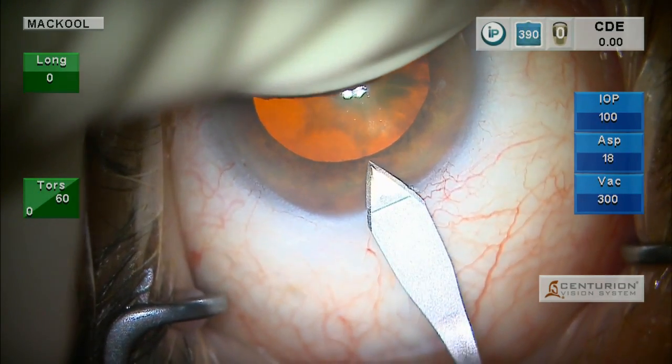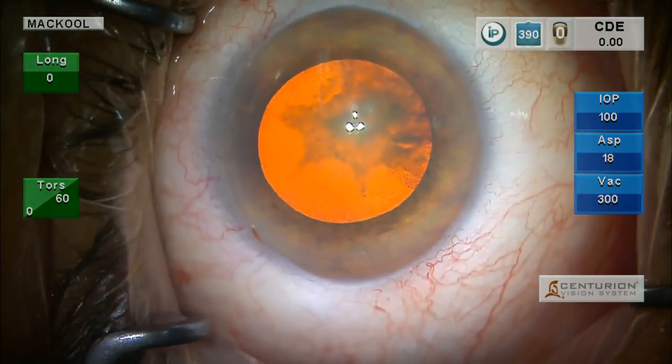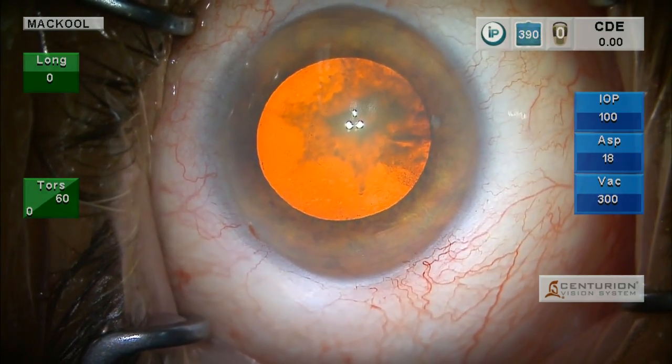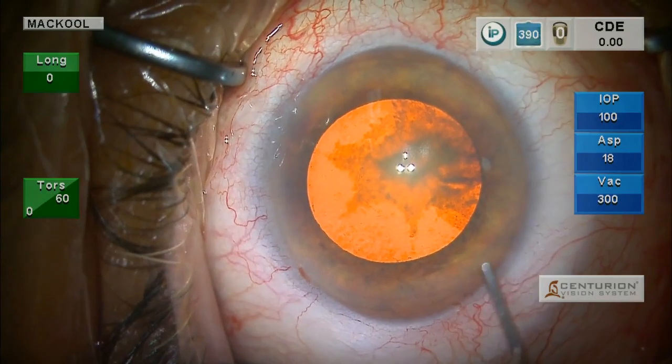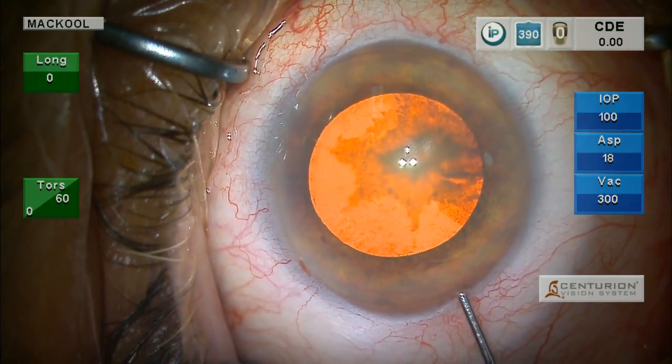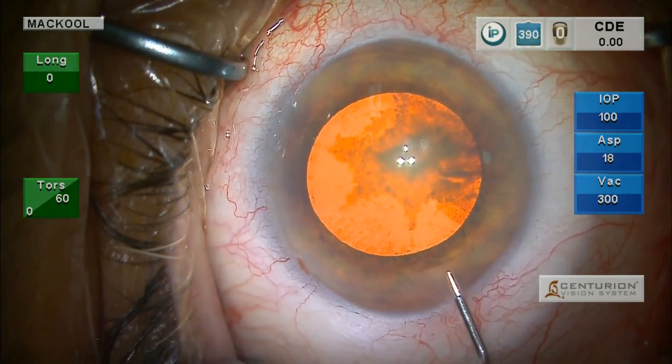We're making our 2.4 clear corneal incision. We just made the side port incision with the eye knife. Some of these patients have a low endothelial cell count, so you may want to do an ECC pre-op.